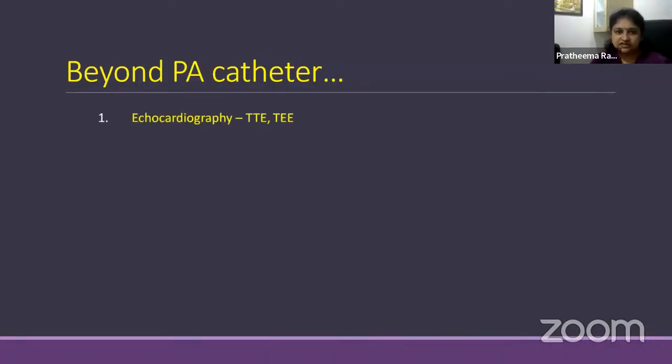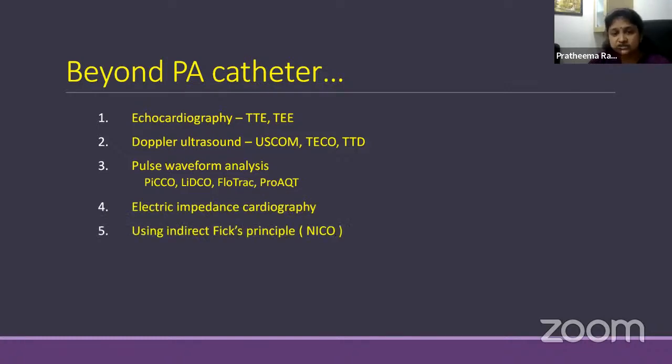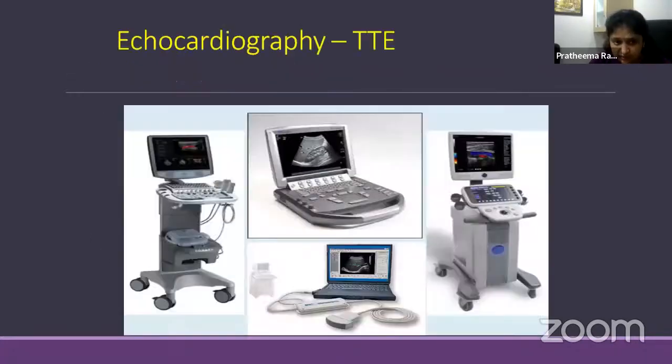So echocardiography, this is going to be there for many years together, either transthoracic or transesophageal. There is also a Doppler ultrasound, which we'll be talking about. Then pulse waveform analysis, PiCCO, LiDCO are minimally invasive. FloTrac is also the same, it needs an arterial line in situ. And we also have electrical impedance cardiography. And we have other NICO, which uses the indirect Fick principle, and bioreactance and NexFin.